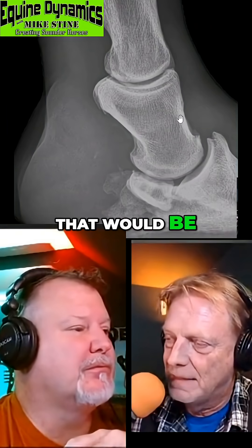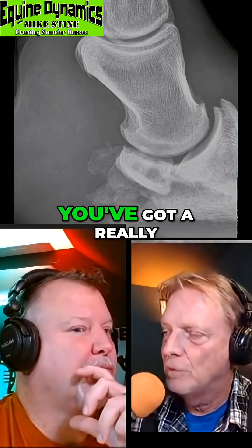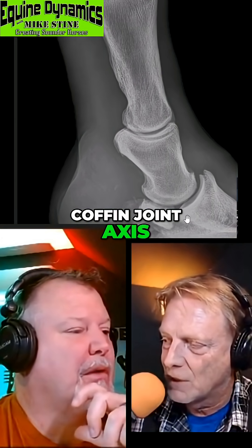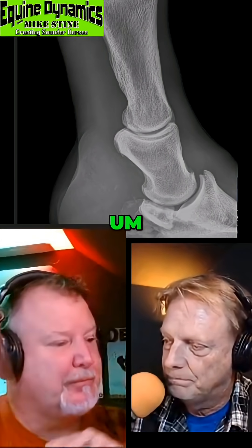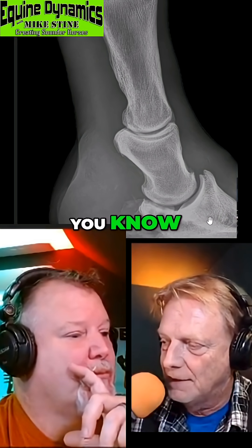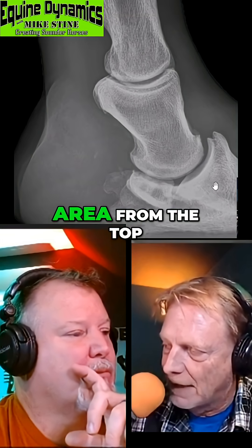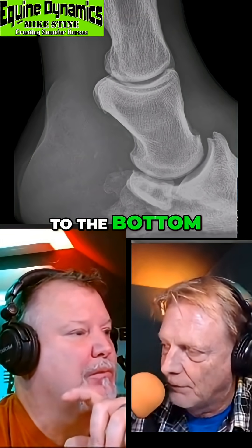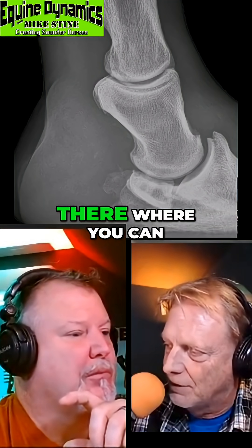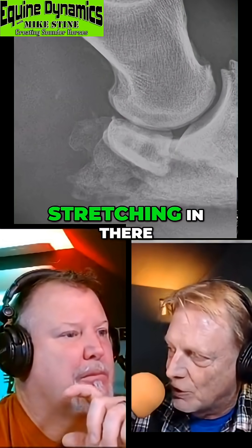Okay, that would be the right side. You've got a really broken back hoof — broken coffin joint axis — and the bony column alignment is nowhere near where it's supposed to be. It's a negative palmar angle. But if you look at the white line area from the top to the bottom, you can actually see that opaque line where the lamina is. It's not showing stretching in there.